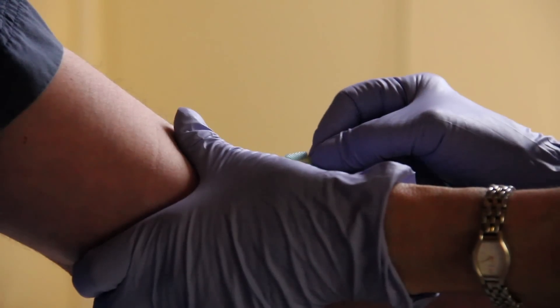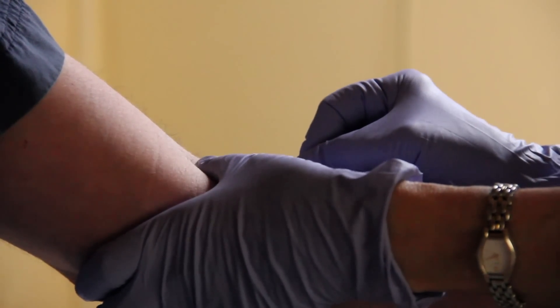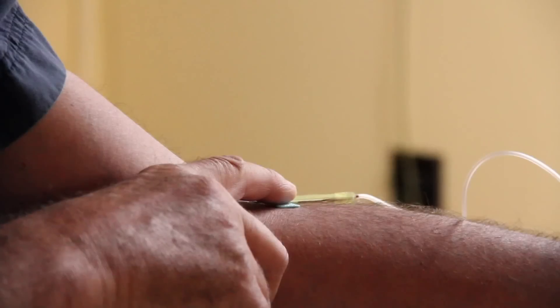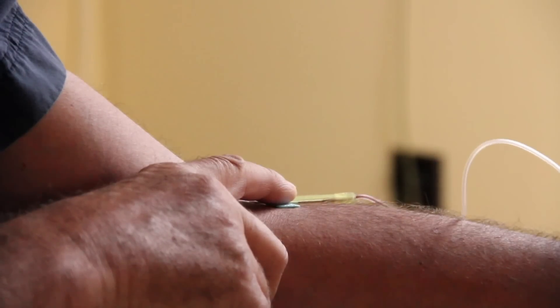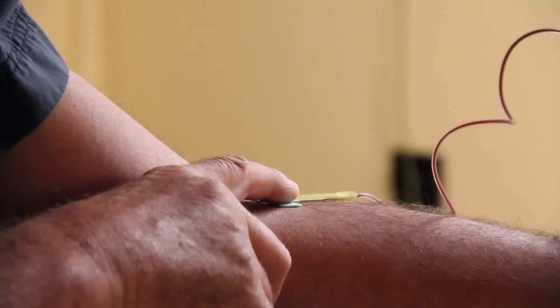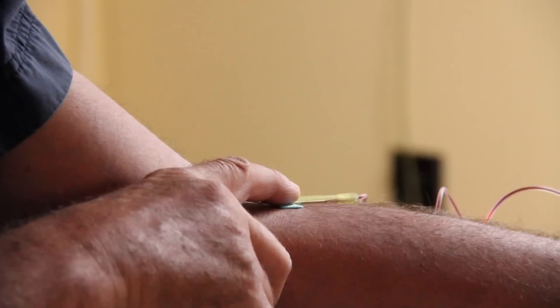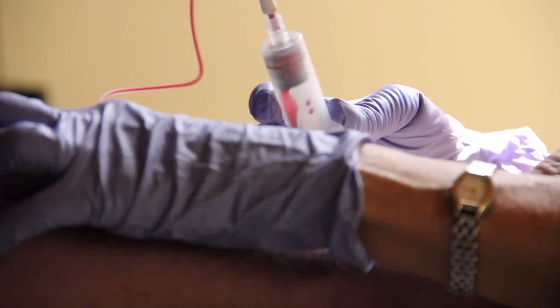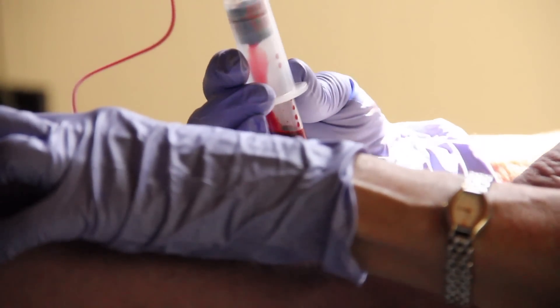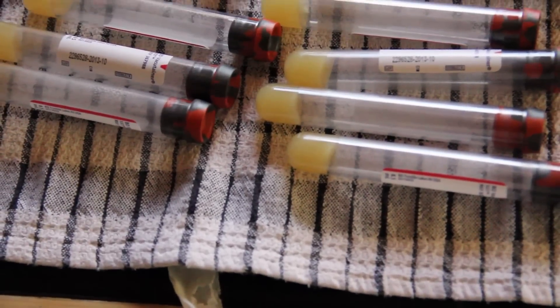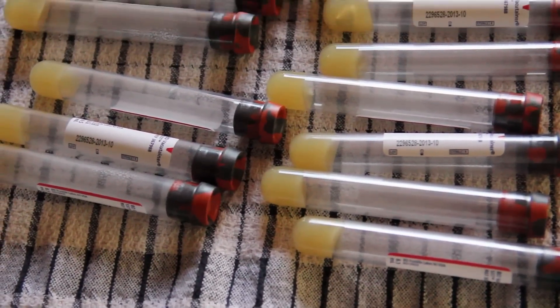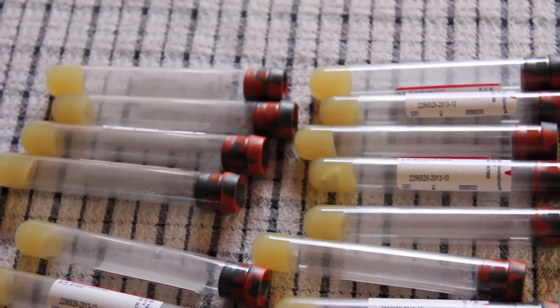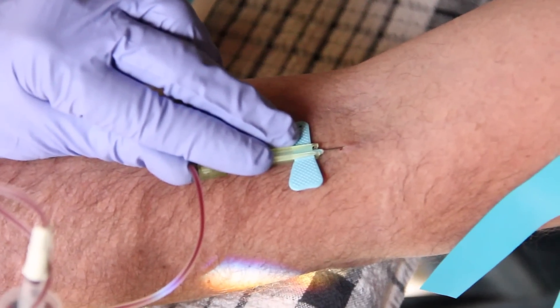I have a friend here who was a nurse taking my blood. She's using a 23 gauge butterfly needle, but a larger needle would work a little bit better. I'd like to get 16 tubes, which means I'll end up with 32 bottles of eye drops that should last me about four months.